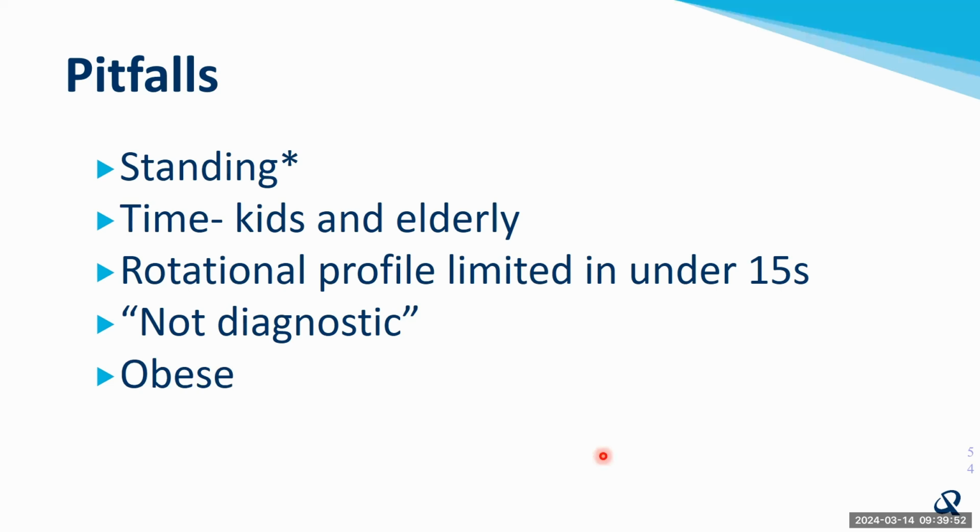And for the same reason, in some of our larger patients, image quality is pretty limited, particularly on the AP projection. Just by virtue of that apron, you really can't see too much going on in their pelvis or a few other places.